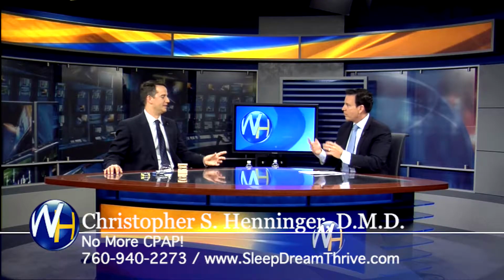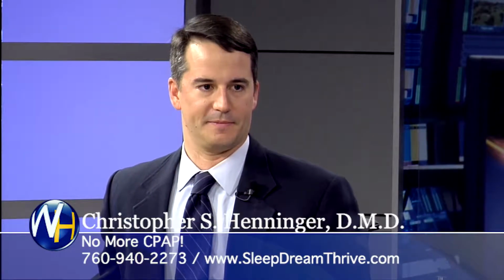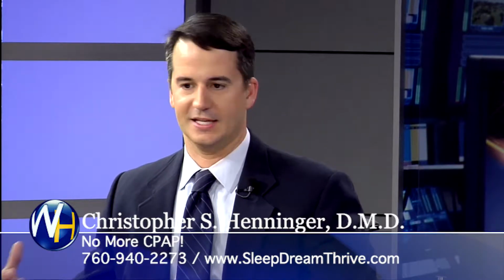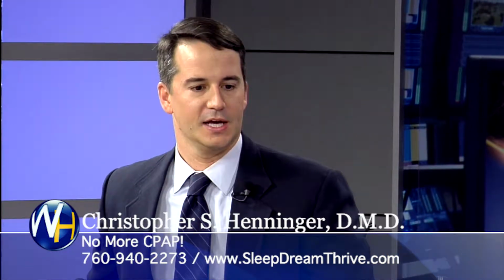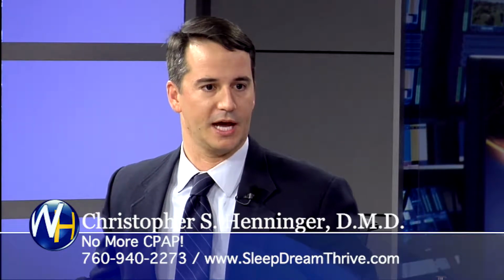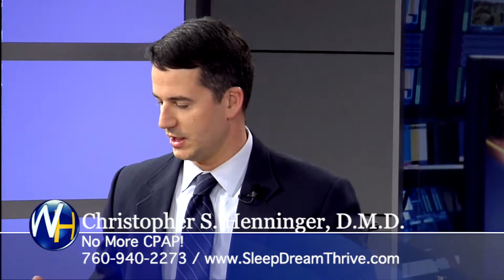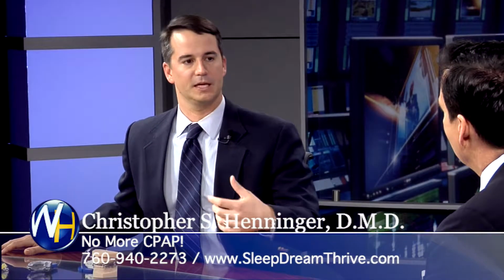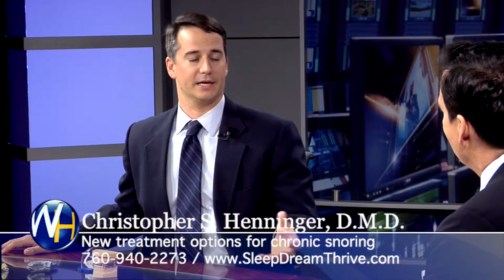So explain to me how it works. Their airway is being blocked and you're opening it up? Randy, the typical treatment for obstructive sleep apnea has been the CPAP machine. It's this large machine that sits on the side of your nightstand, and it's a big mask that you wear over your face, and it blows air down your throat all night long and keeps the airway open so you can have that restful sleep. This solution is much simpler. All it does is advance your lower jaw to keep the muscles from collapsing the back of your throat, making it easier for you to breathe at night.